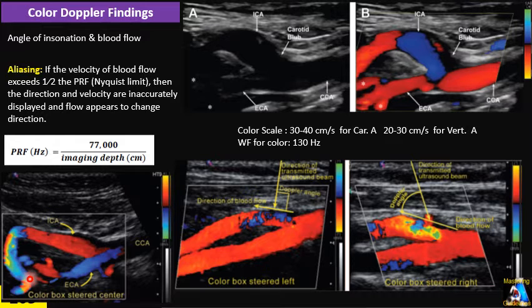Color Doppler gives a lot of information that includes detecting blood flow, quality and quantity of the blood flow, including direction of the blood and relative velocity and the pattern of the blood flow. Is that high velocity or not? Do we have turbulence or aliasing or not? That helps us to detect the spot that has a narrowing and stenosis. Let's see how it helps us.